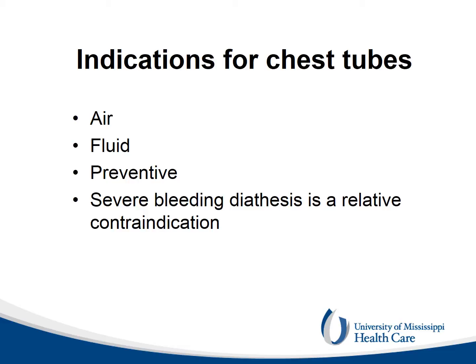Most of the indications for the placement of a chest tube are the presence in the pleural space of a significant amount of air, called pneumothorax, or fluid, called hydro, or chylo, or hemothorax. Sometimes a chest tube is inserted preventively in critically ill patients when mechanically ventilated with very high mean airway pressures. Caution needs to be used in patients with bleeding disorders.